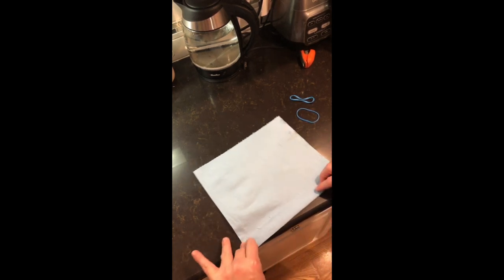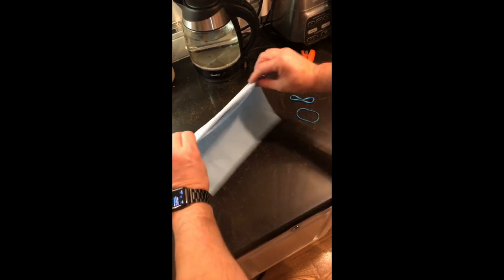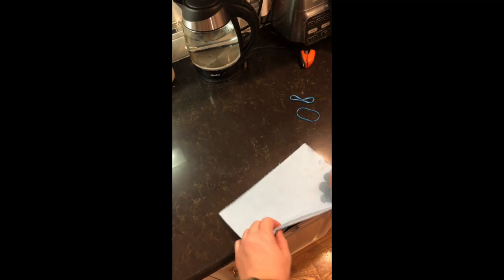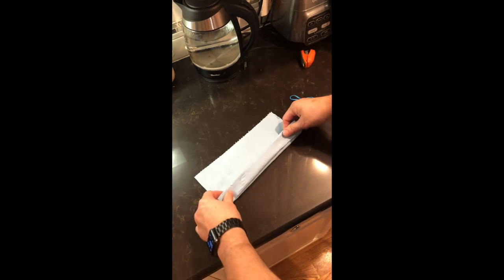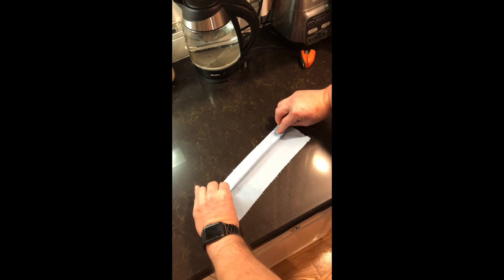You're going to do about a three-quarter inch fold and keep folding it back and forth. You'll need a paper towel, two rubber bands, and a stapler — that's all you need. Just keep folding it back and forth; it makes a corrugated shape so it fits tightly but also expands around your nose and your chin. It'll fit over the top of your nose and go down below your chin.